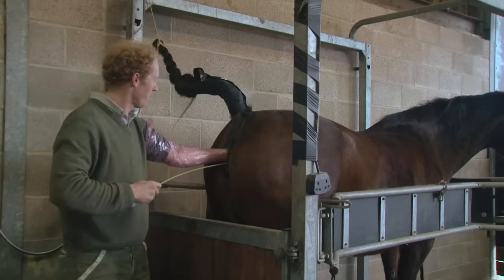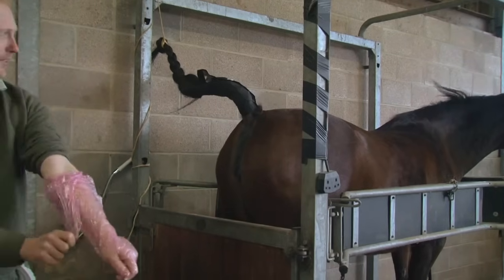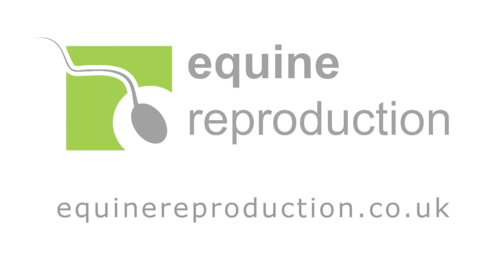The catheter and gloved hand are gently withdrawn and the AI procedure is complete.